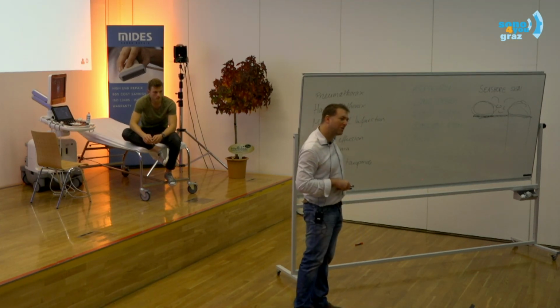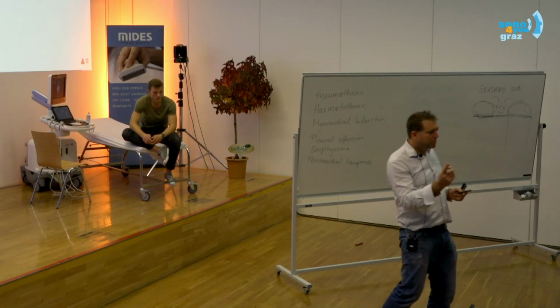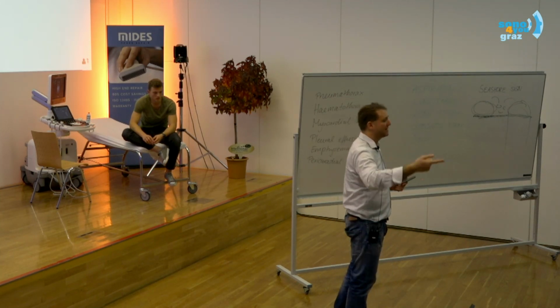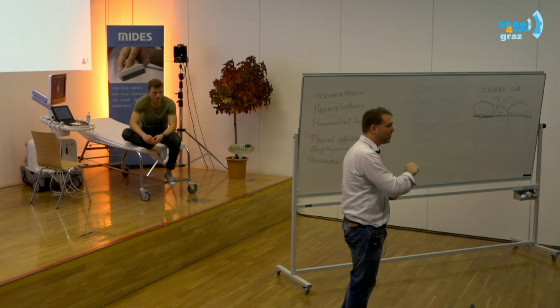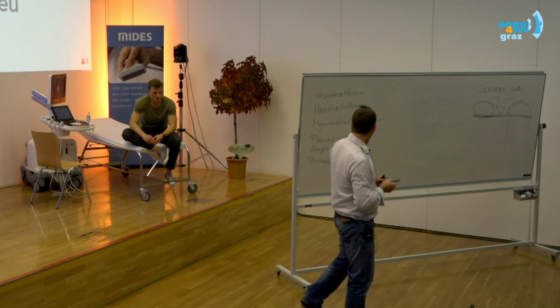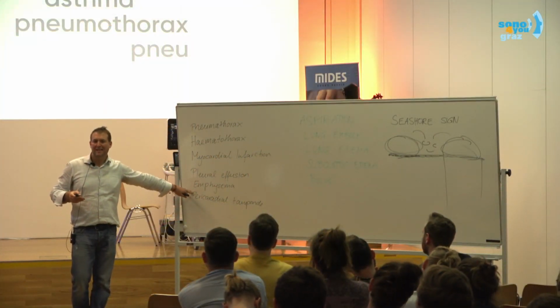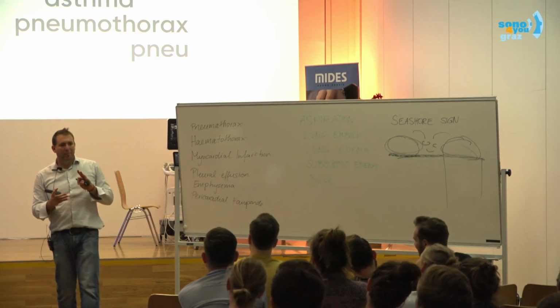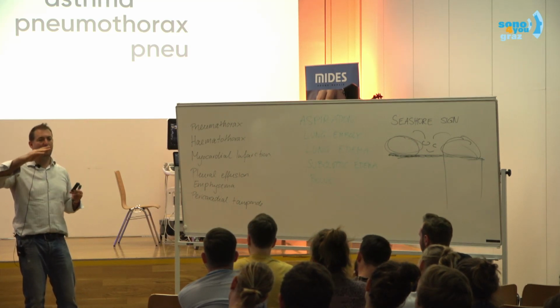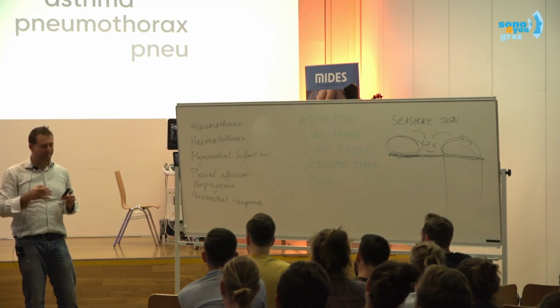Myocardial infarction, can we see that on lung ultrasound? If myocardial infarction produces pulmonary edema, then indirectly yes. But we don't know if it's because of myocardial infarction, right? So we need EKG and echo. Pleural effusion, can we see? Emphysema, can we see? Not really, but over one big emphysematous bulla, we would see lack of lung sliding, similar to pneumothorax, okay?